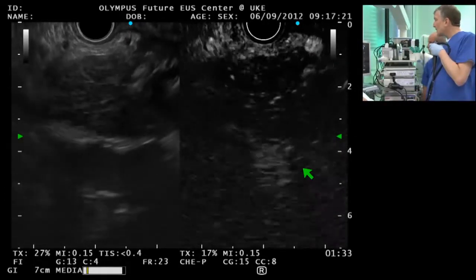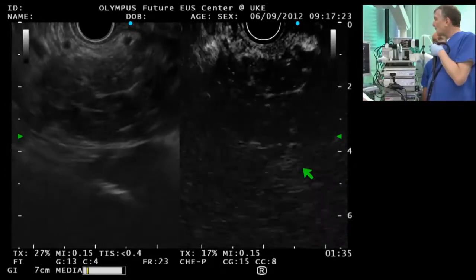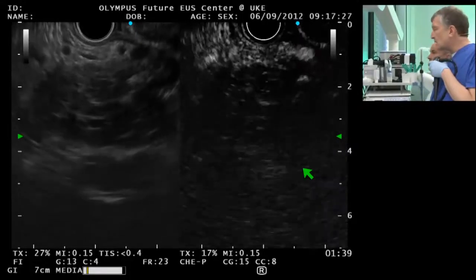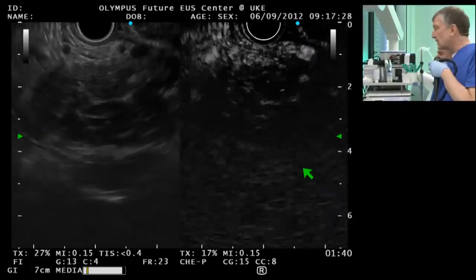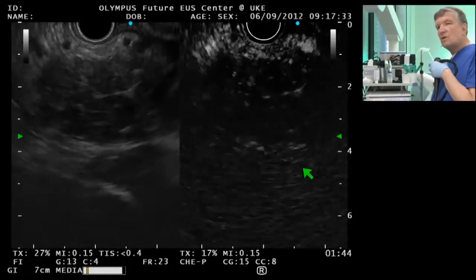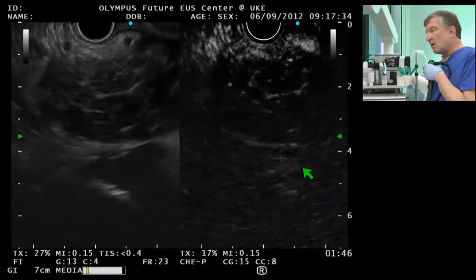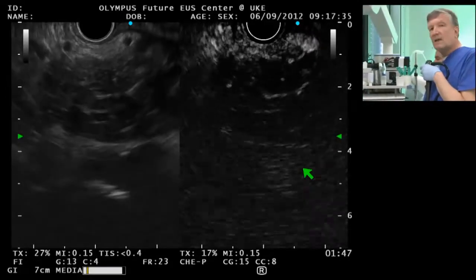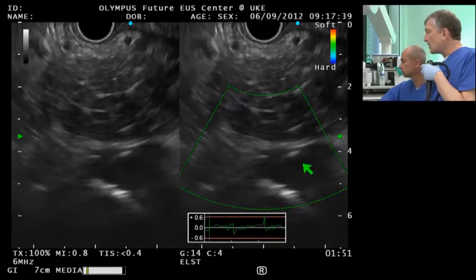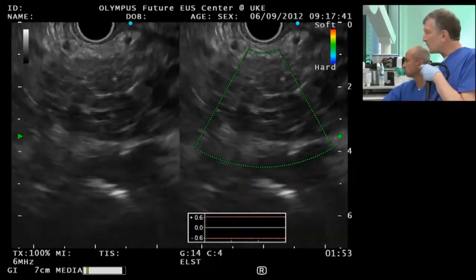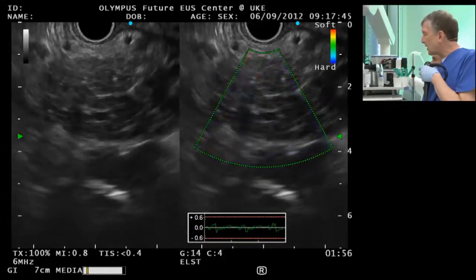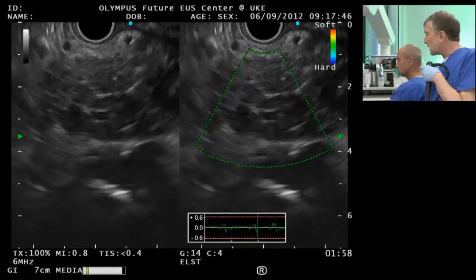Well, we had two concerns. The main concern was that this might be a tumor, because then the entire treatment is changed. If we are sure it's not a tumor, it's a stone obstruction, which we now clearly are. Then there's the question about the history of the patient, how much pain he has. He told me before that in the last three, four months he hardly had any pain.